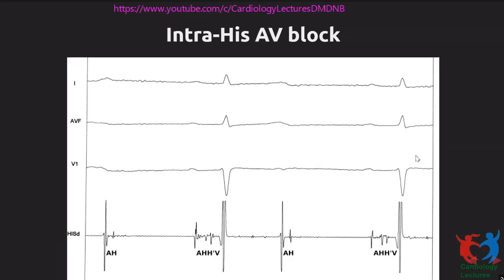had syncope, had some documented intermittent complete heart block, and on EPS what we find is that there is disease of the his bundle, so that the his conduction itself is prolonged. There are 2 his potentials, and the block happens after a first his potential. So after the A, we see 1 his potential, and then we do not see a second his potential, implying that block is happening within the his Purkinje system. And this is a rare condition known as intra-Hisian AV block. Again, needs to be paced.